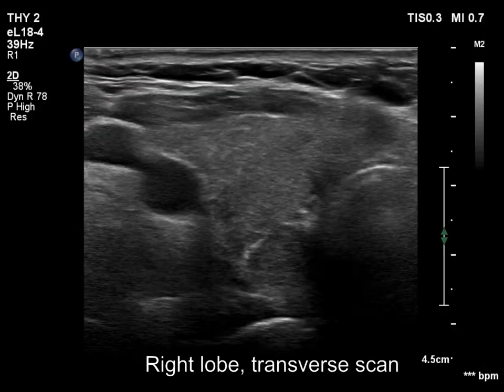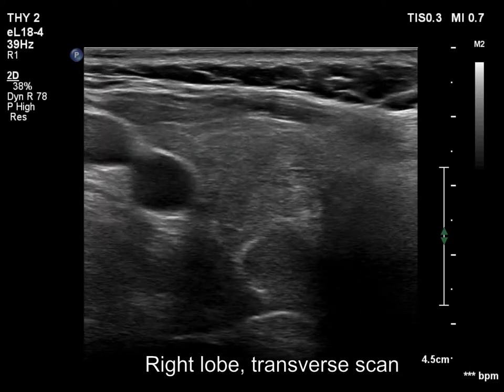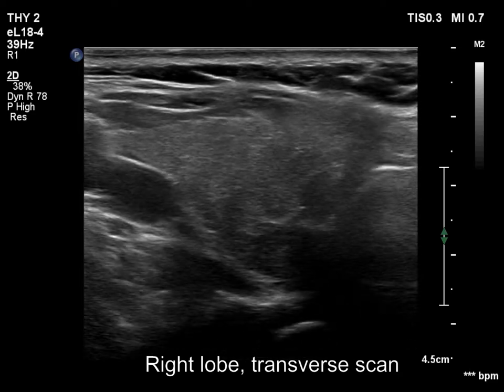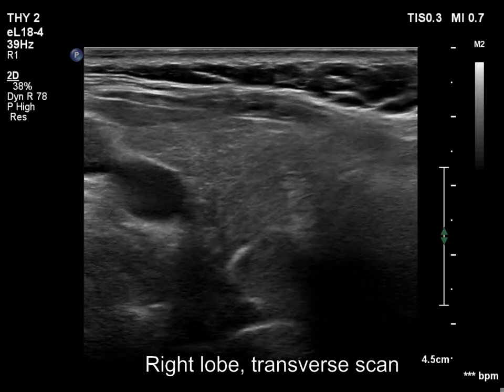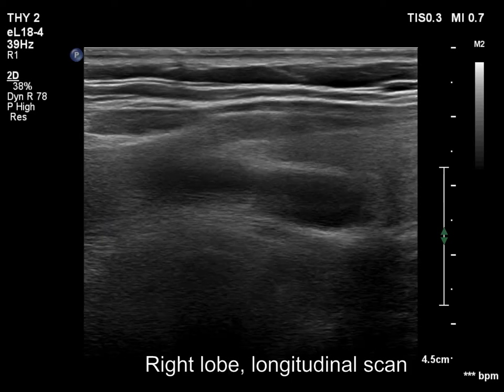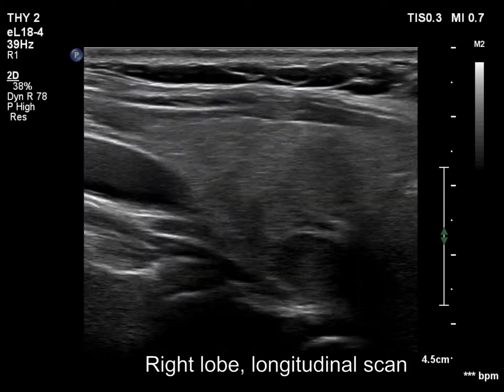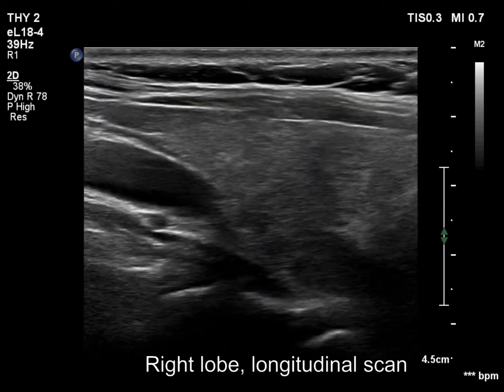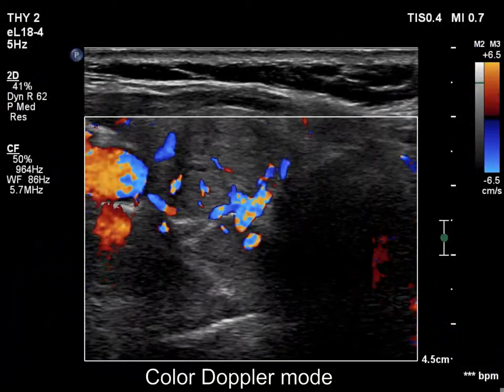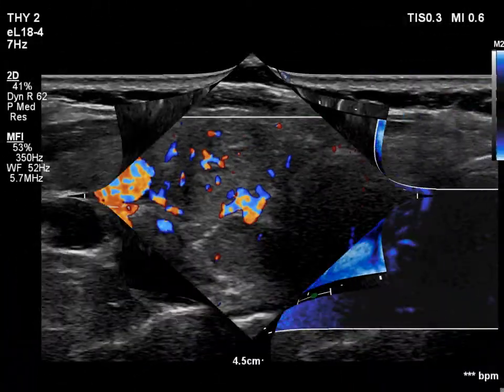The right lobe has a larger iso/hyperechoic and a smaller hypoechoic lesion. The latter could also be a parathyroid gland based on its location. The vascularity is nonspecific.